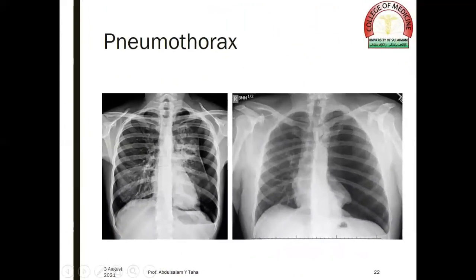The presence of air in the pleural space, called pneumothorax, may be a large pneumothorax causing total collapse of the lung, like the film on the left side, or it might be a partial pneumothorax.